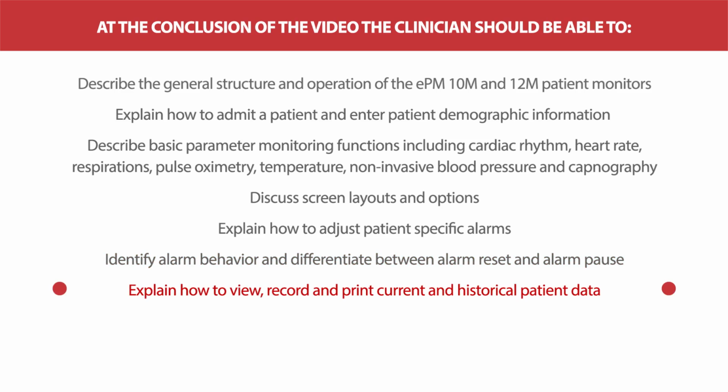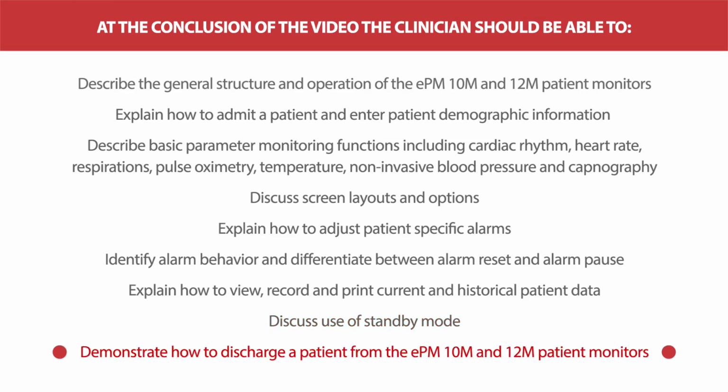Explain how to view, record, and print current and historical patient data. Discuss use of standby mode. Demonstrate how to discharge a patient from the ePM 10M and 12M patient monitors.